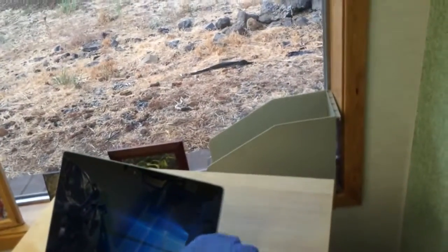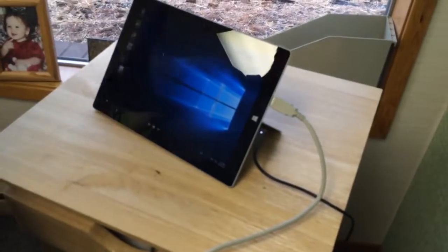And go ahead and just plug it in. This is the power cord right here. Plug it in right here below. The little light comes towards the front. And there you go. The light comes on, I mean, it's powered. And you're set to go.